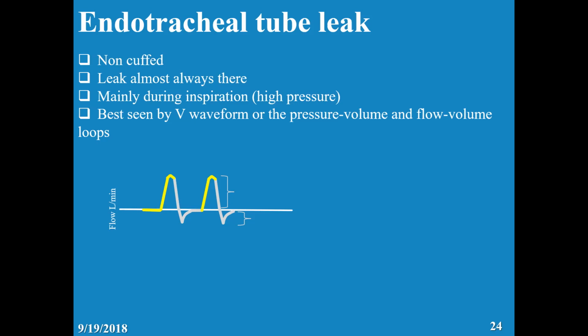Can you please repeat, dear doctor? So it always has to go back to zero. Yes. And the in equals out. Yes. If it's not coming to zero and you don't understand, call somebody. And if they are not equal on both sides, there is something wrong, call somebody. Is that difficult? No, it's clear.